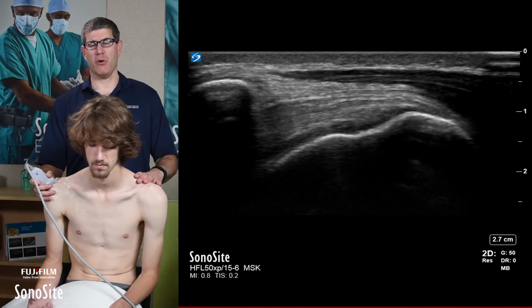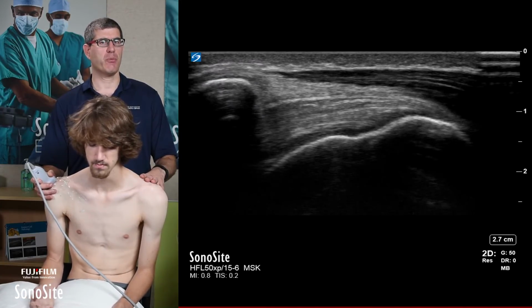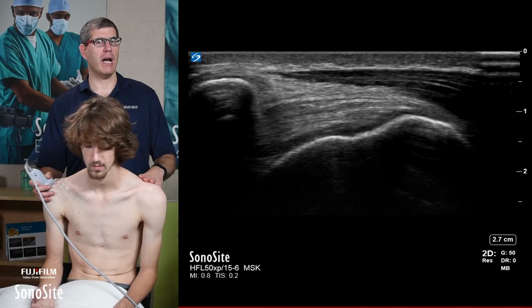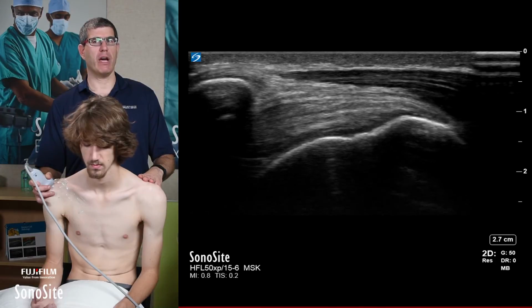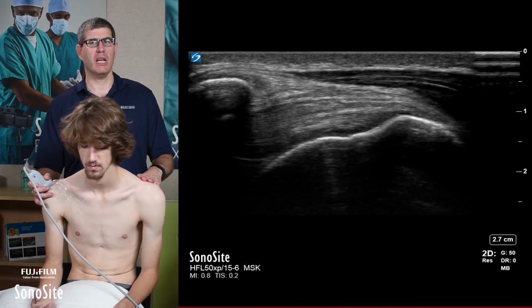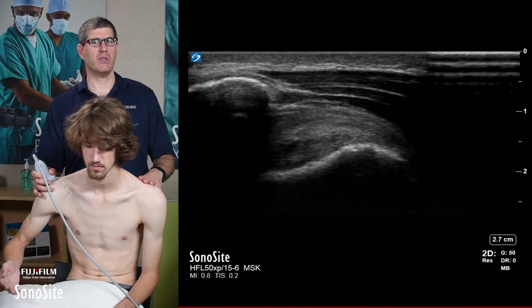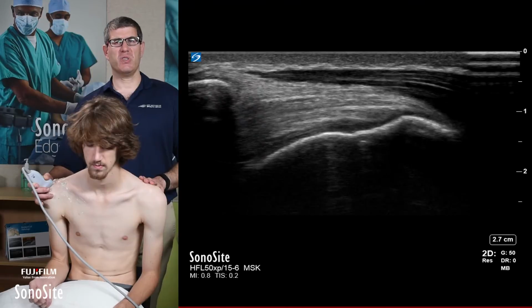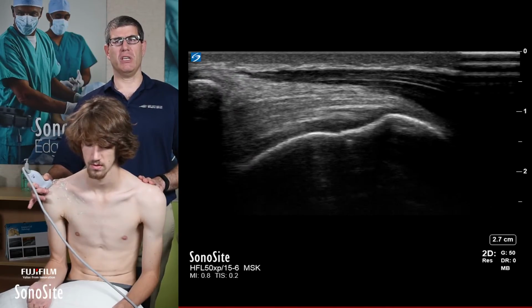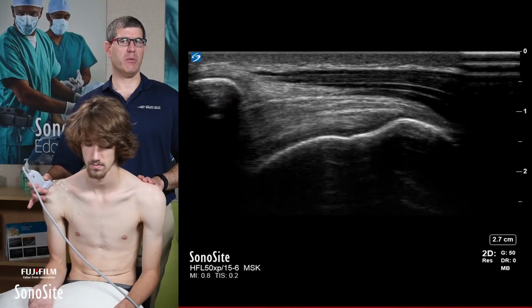One of the things I'm doing is, even though I have the entire footprint of the supraspinatus, I'm putting pressure onto my right thumb, which is the part sitting on top of the acromion. That way I don't collapse down on the bursa. If you can bring your arm into an abducted position, I can see it going underneath and back down. And I can see at what angle his arm is when the lateral edge of the supraspinatus goes underneath the acromion. So keep going upward.